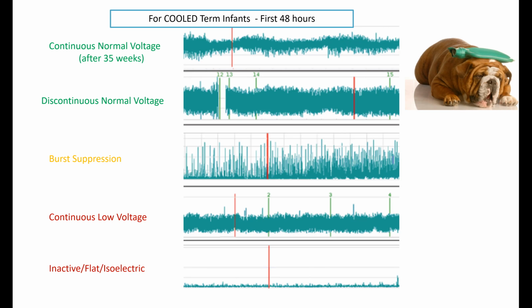So this is why we really advocate for continuous monitoring, and if you stop continuous monitoring, to resume continuous monitoring around the time of rewarming, because it's a small risk, but there are many babies who will, in fact, seize during rewarming. I'm blanking on the number. Of total infants, I want to say it's in the 20 to 30% range who do seize, who have HIE and who are being cooled. Polly might be able to answer, or somebody else.